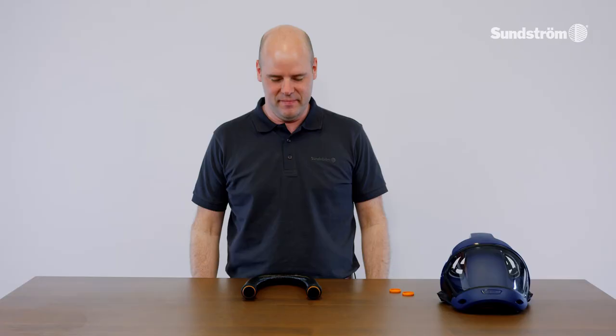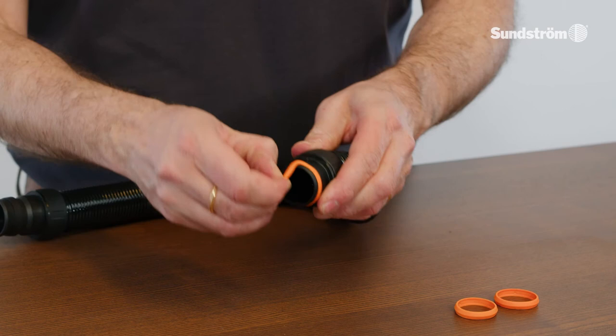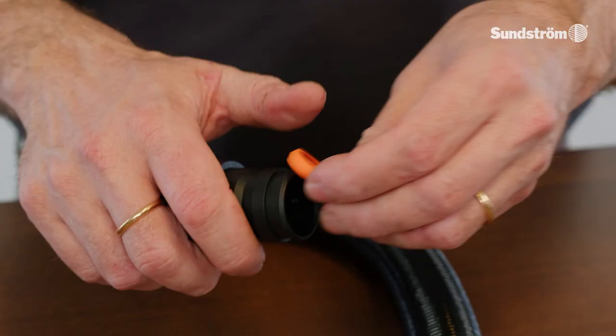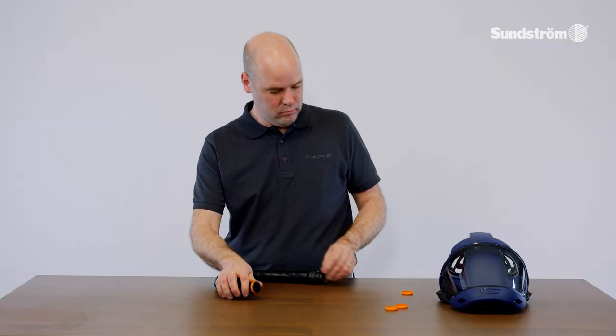Change the gasket for the breathing hose. Remove the gaskets. Clean the connections and the packing groove. Mount the new gasket. Clean the new gasket.